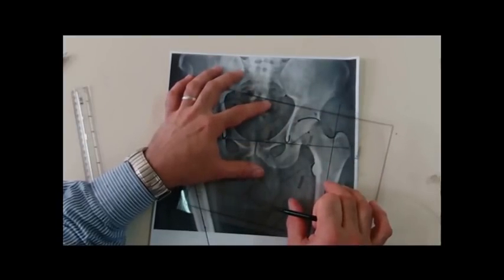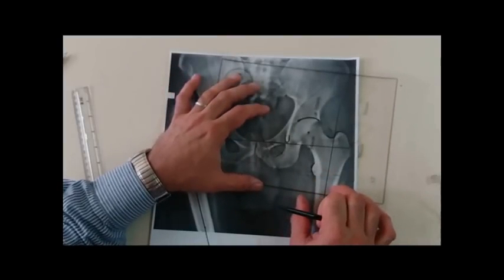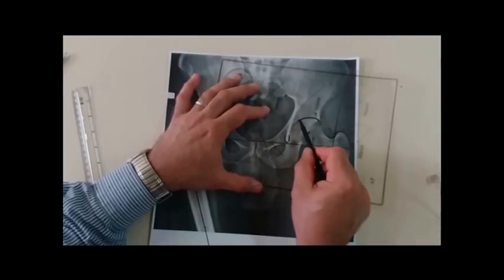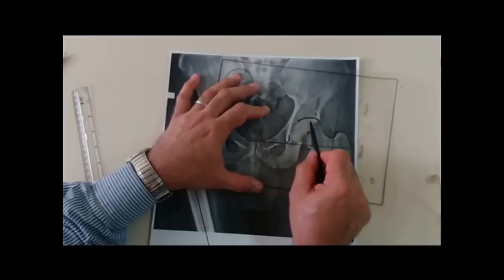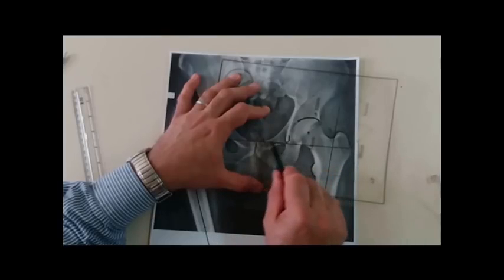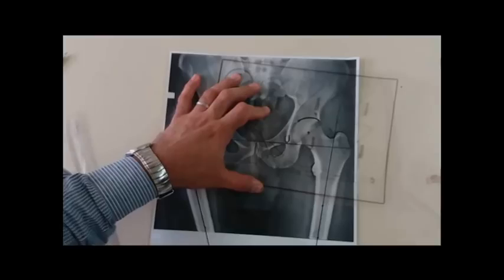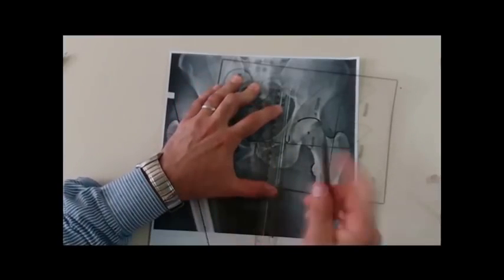For example, 51 is not adequate. I will depend on 54. This acetabular floor coincides well with the template of the acetabulum, and the inferior edge of the acetabulum does not go down the interteardrop line. And what is very important is that this point will be highlighted in the other side.